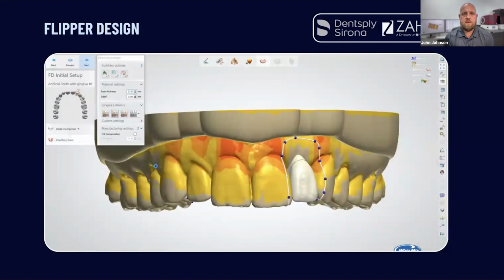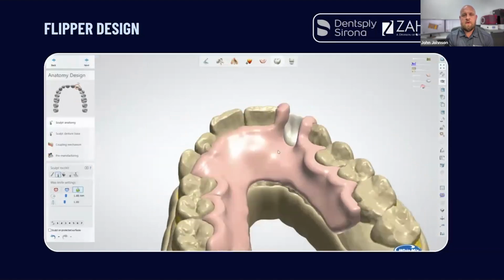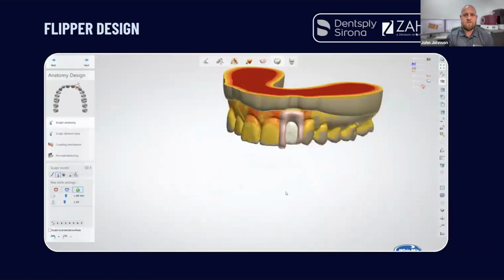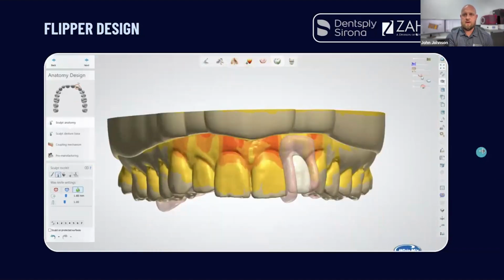And then this is a min thickness of 2.5, and I'll show you. It's got that overlapping, so see how it makes that little bit of a weird output. But you're able to go back through and sculpt that back to the socket that you would like. You have to get through that step to get there.